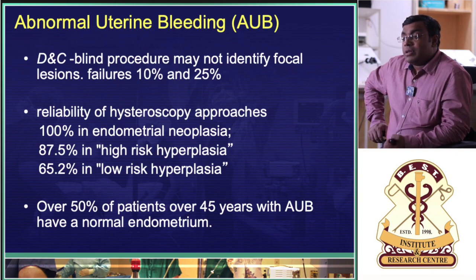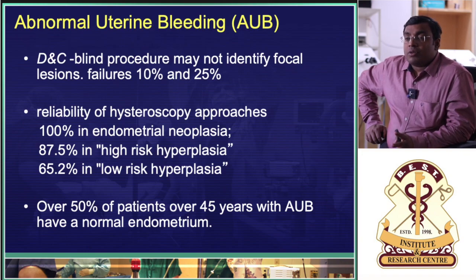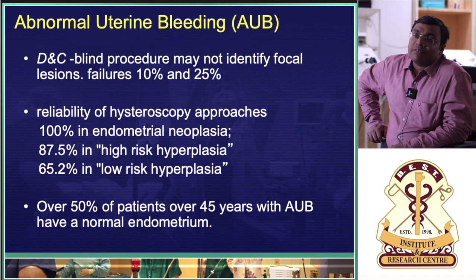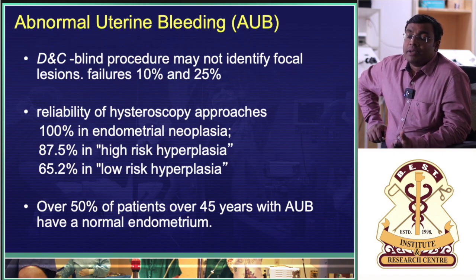Okay, so such small things will make a lot of difference. Actually, 8 months following hysteroscopic polypectomy, she conceived spontaneously. So we should not dictate what is going to happen. You should do what is needed for that patient. Let it take its course. But you should always tell, I will do a hysteroscopy, take out the polyp. Conception, either you will have to get treated.